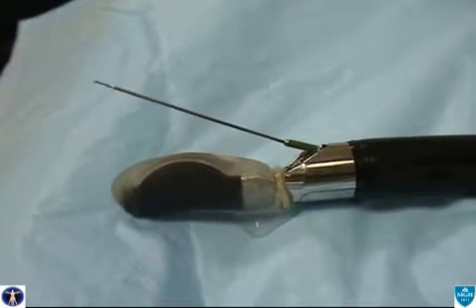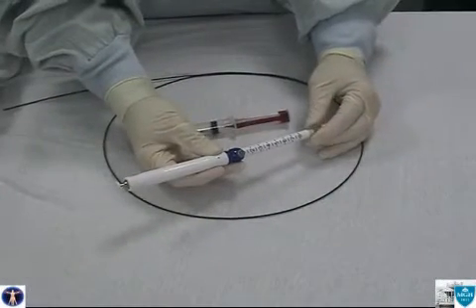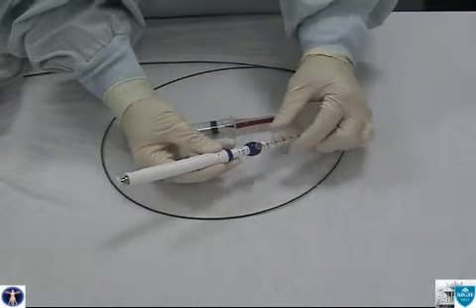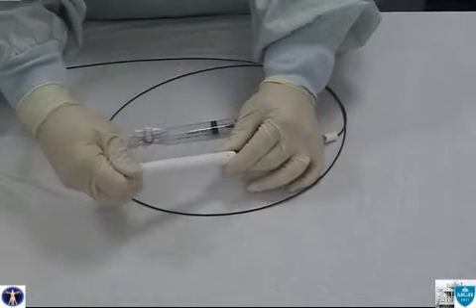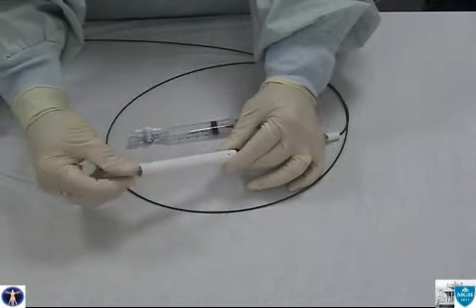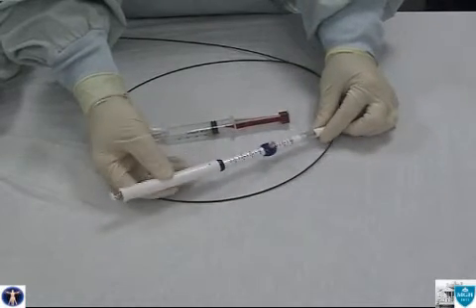A 22-gauge needle is exiting from the sheath, and an elevator controls the excursion of the needle. Prior to FNA, the FNA device will be assembled. This is a one-stage 22-gauge needle by Wilson Cook. A stylet is placed within the needle and can be easily moved back and forth. Nitinol provides flexibility of the sheath.